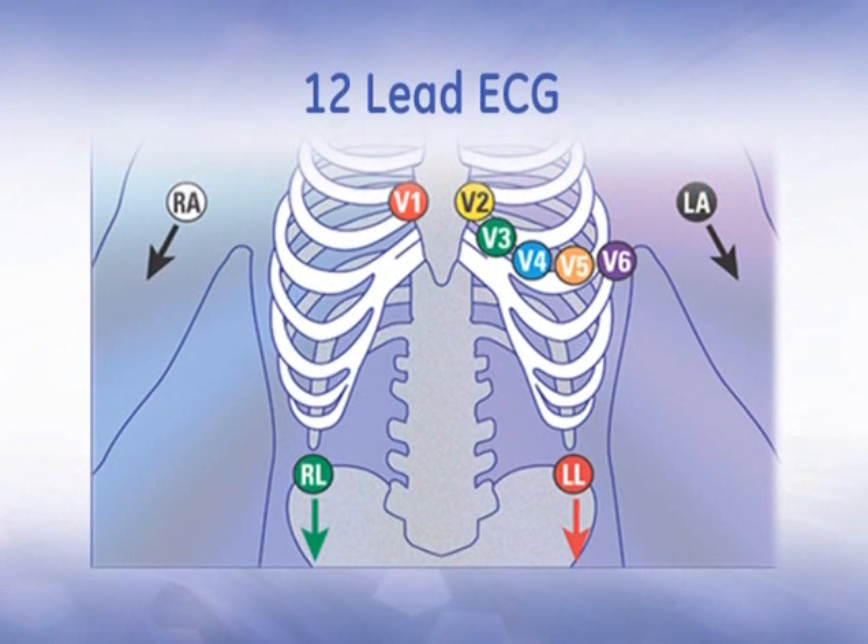Now you're ready to place the electrodes. This is the electrode placement for a standard 12-lead ECG. Begin by placing the right leg and left leg electrodes on the corresponding ankle, and the right arm and left arm electrodes on the corresponding wrist. Then place V1 on the 4th intercostal space next to the sternum on the right side. V2 is placed in the similar rib position as V1 but on the left side of the sternum. V4 is positioned at the mid-clavicular line in the 5th intercostal space. V3 is placed midway between V2 and V4. V5 is positioned at the anterior axillary line on the same horizontal level as V4. Place V6 at the mid-axillary line on the same horizontal level as V4 and V5.